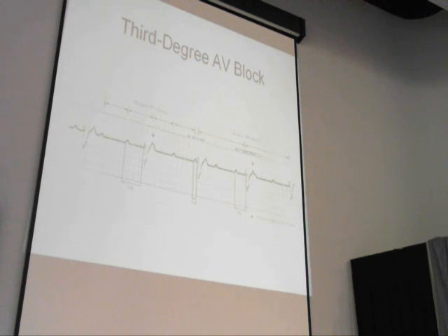Atropine. Say we gave a milligram of atropine, we assessed, we monitored, and 5 minutes later we repeated that dose. 5 minutes later we gave the third dose of atropine, no response. Guess what? Probably not going to get a response. What's our next thing to do to maintain this patient so we can get some tests, x-rays, and find out about a pacemaker? Transcutaneous external pacing.